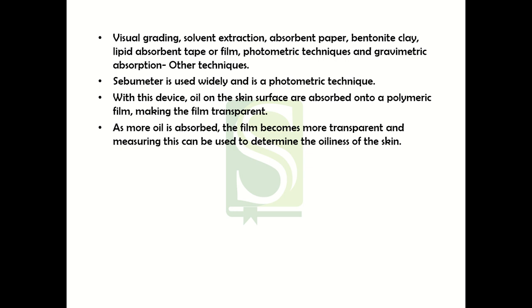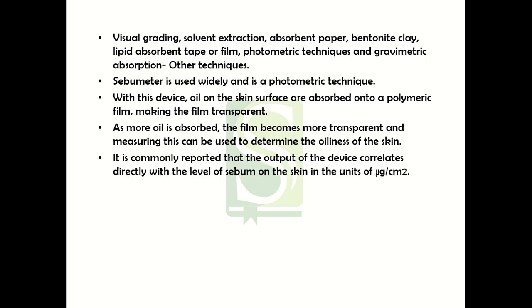Okay, so if the skin is less oily, less amount of oil will be absorbed and the film will be less transparent, but as more oil is absorbed, the film is going to become more and more transparent, and hence you can determine the oiliness of the skin. Okay, so it is very commonly reported that the output of the device correlates directly with the level of sebum on the skin, and it is given in the units of microgram per centimeter square.